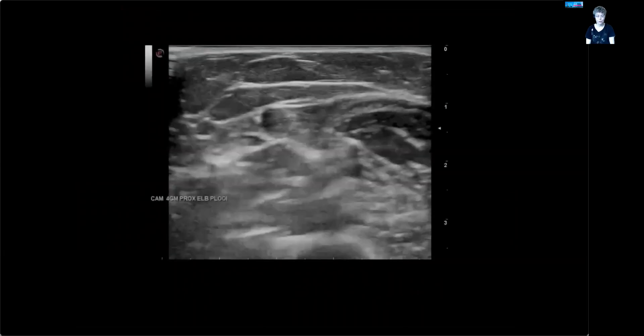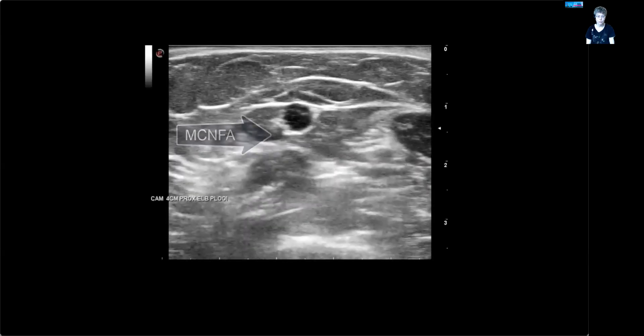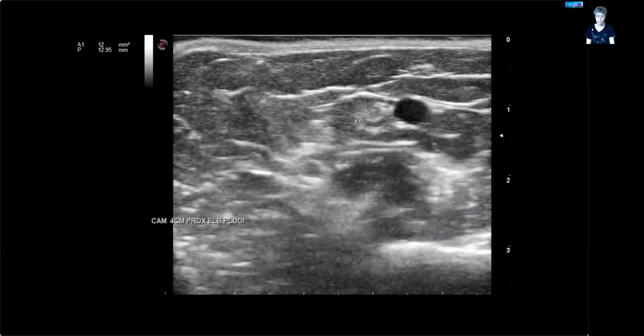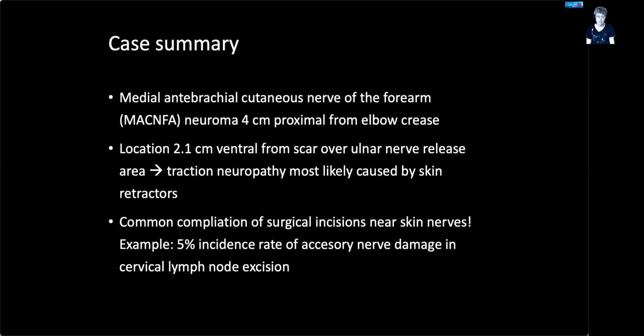Here's a measurement showing the nerve is two square millimeters large in this person. And here's a case video of the patient with the injury after ulnar nerve surgery. It's not a pretty ultrasound picture, but you can see the medial cutaneous nerve and then a swelling — that is a neuroma. After that, the nerve could not be found anymore. So the nerve is 12 square millimeters here, six times the normal size. The location was next to the scar, so most likely this is a skin retractor lesion.